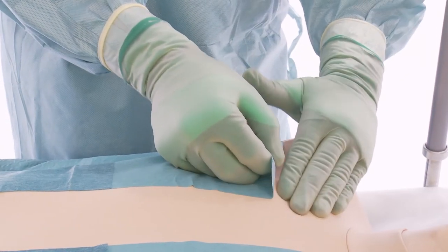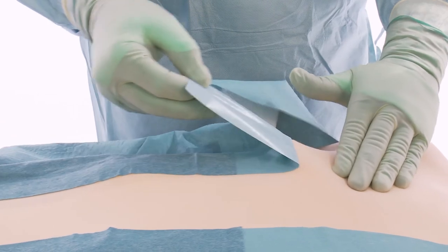When removing the drapes, take care to support the patient's skin while gently lifting the drapes.